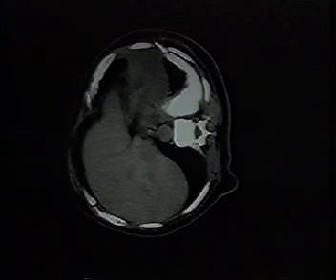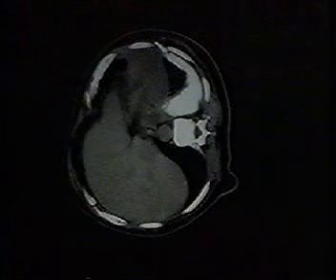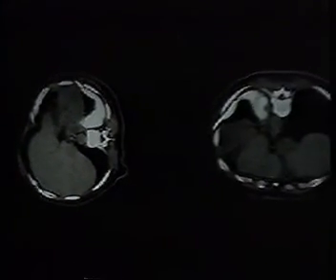Here's an example of a patient in whom a catheter was placed for a dependent left posterior pleural fluid collection, and the patient initially did very well, but fever and white blood cell count elevation returned, and we brought the patient to CT to try to determine why we had not adequately drained the collection. It wasn't obvious from the chest films what the problem was, but when we brought the patient to CT, we instilled some contrast through the catheter, and you can see that the fluid collection that the catheter is within seems to be communicating with the catheter very well, but that there is a fairly large subpulmonic fluid collection that does not appear to be communicating with the more posterior collection.